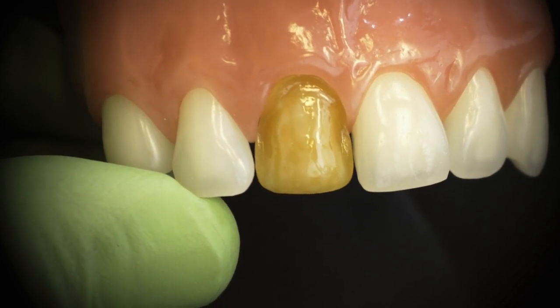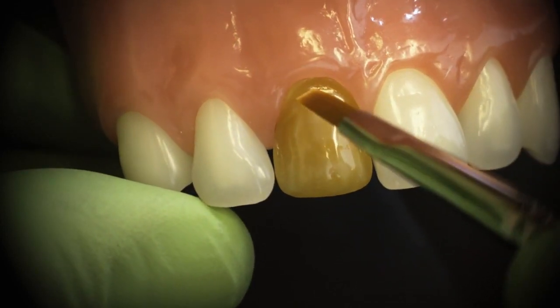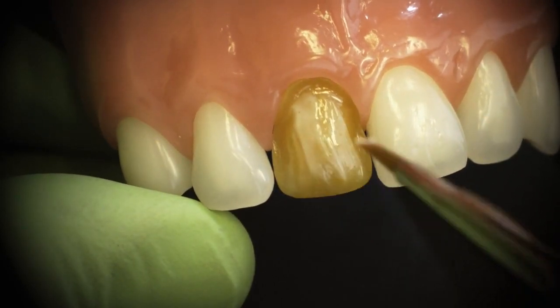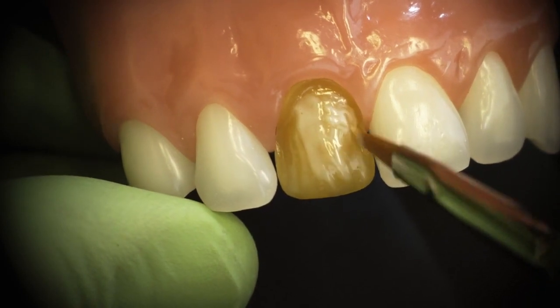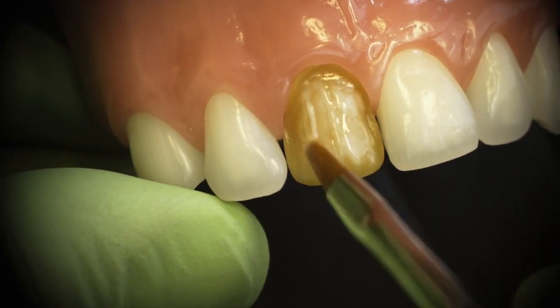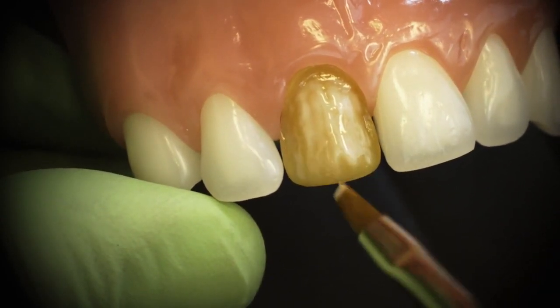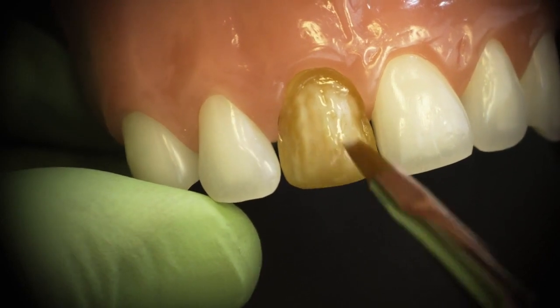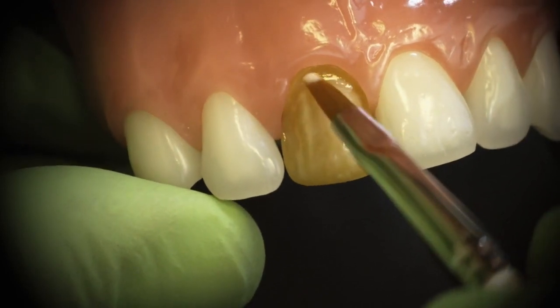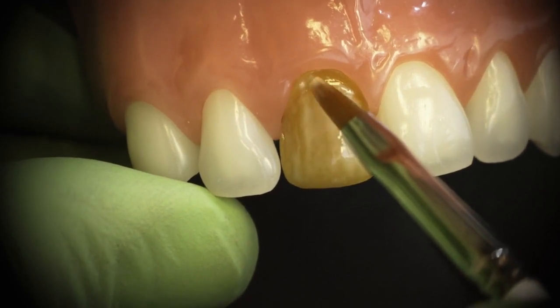I'm going to go back and grab a little bit more pink opaker with my brush and bring the pink opaker onto the tooth with gentle brush strokes. It's absolutely fine for some of the natural tooth color to be shining through a little bit — we do not need to block this out entirely. We want the overall effect for the tooth value to raise, to brighten, but we don't want to turn it into just a white or a pink tooth by over-opaking.